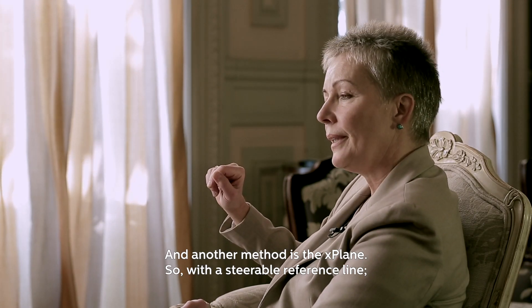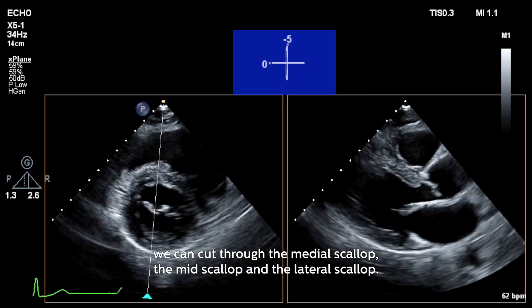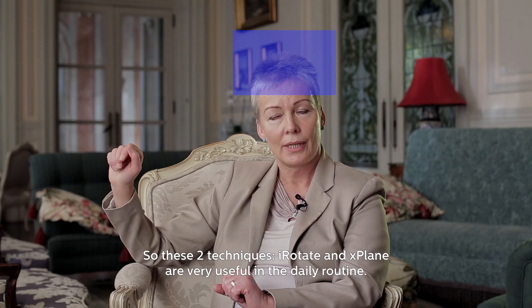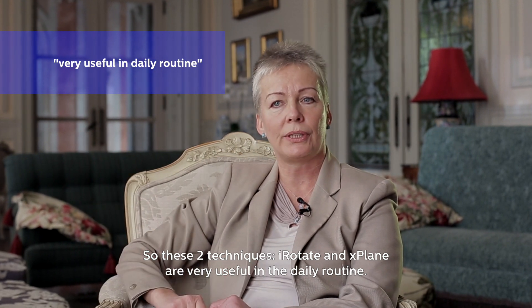Another method is the X-plane. With a steerable reference line, we can cut through the medial scallops, the mid-scallops, and the lateral scallops. These two techniques — I-Rotate and X-plane — are very useful in the daily routine.